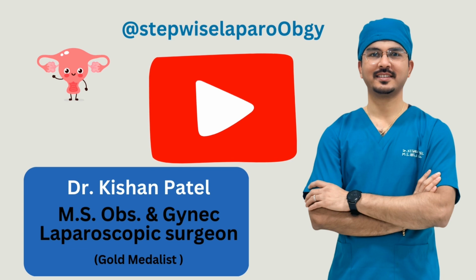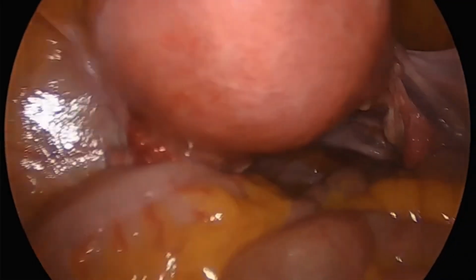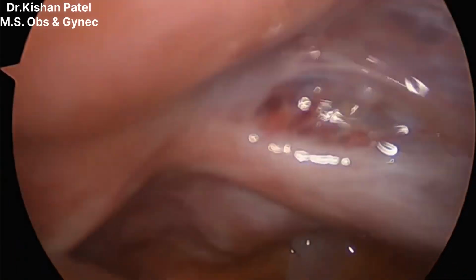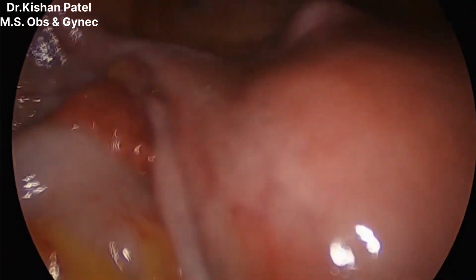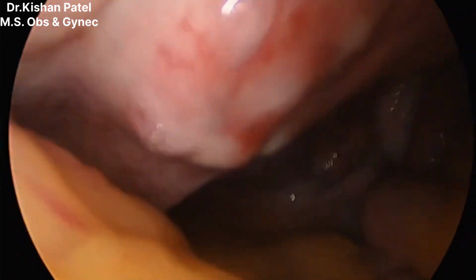Today we will see total laparoscopic hysterectomy. This is the case of abnormal uterine bleeding with multiple leiomyoma. As we can see, at the anterior and left lateral boundary, there are two fibroids present.